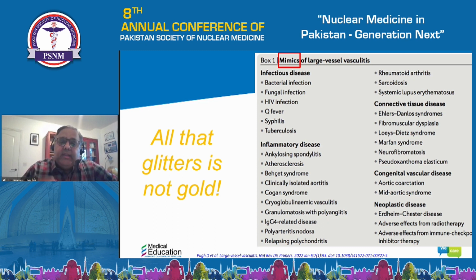So basically, we have to know what we are looking for. The background, the clinical history is most important, and that helps us decipher the patterns of uptake towards a particular diagnosis. Next slide, please.